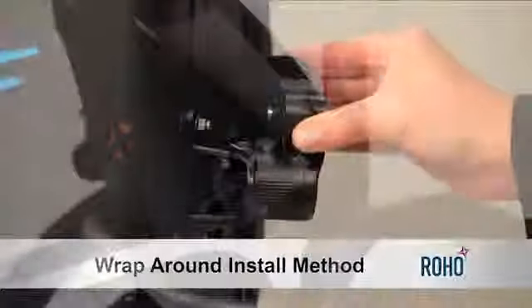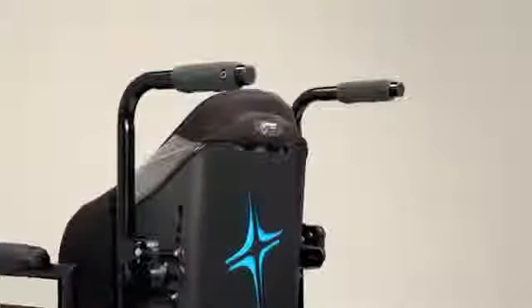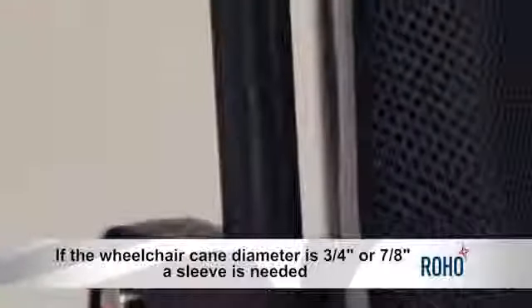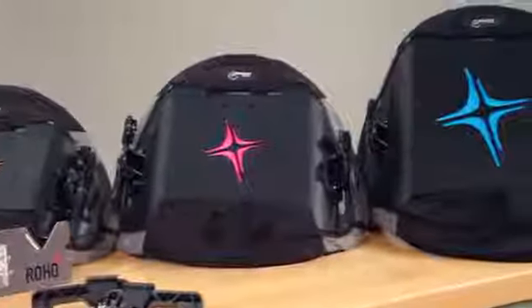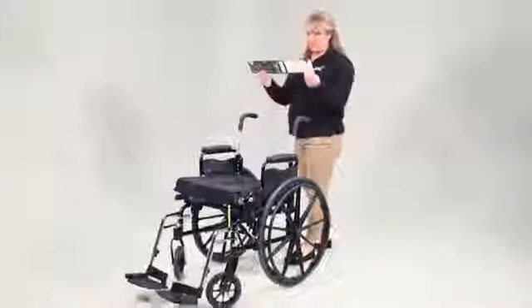or the wraparound install. The quick install is perfect for wheelchair canes without push handles, as shown here. For wheelchair canes with push handles, like this one, you will use the wraparound installation method. If the wheelchair cane diameter is 3/4 inches or 7/8 inches, a sleeve is needed. As with any of our Agility backs, use the Agility slide rule to measure and adjust the width with the triangle bracket for the best fit. Once your triangle bracket is adjusted properly, begin installation.